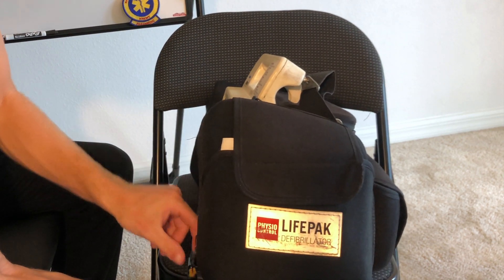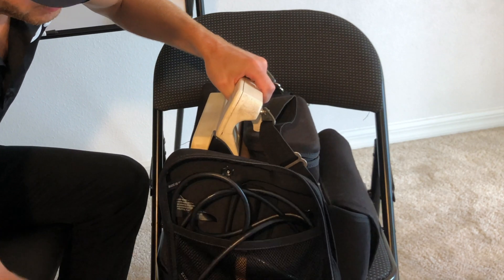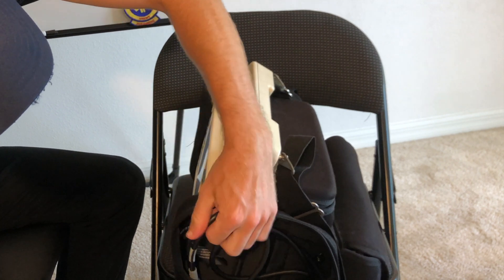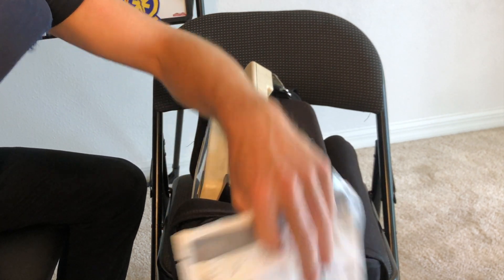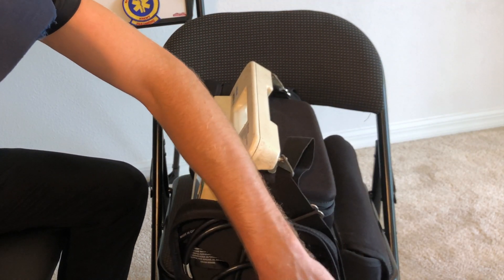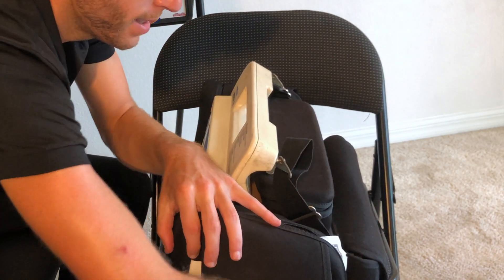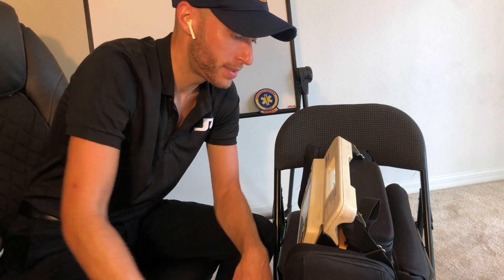Now I'm going to open this up and pop it open for you. So in here we have the pads — it's the pads connector. And it actually kicks in to the pads right here — quick combo pads. You have adult and pediatric pads that go in here, one on both sides however you want to do it. This is how I set up my LifePack — you might do it differently. If you're a medic watching, comment down below how you set up your LifePack or your Zoll monitor.